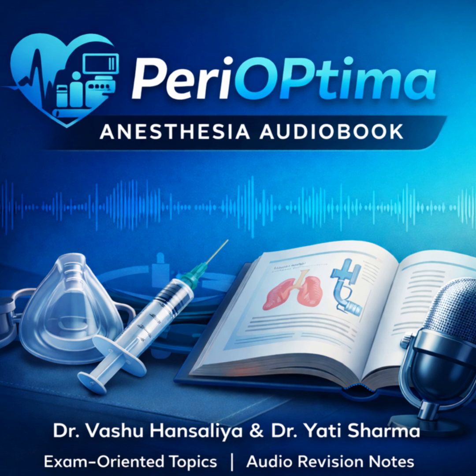Lower. Why? Because we reduced the afterload, the heart didn't have to generate as much pressure to open the valve and eject blood. If the assisted systole is lower, it is direct proof on your monitor that the device is working. So that's the Viva question answer. Show me on the screen that the patient is benefiting. That's it. You point to that lower assisted systolic peak.